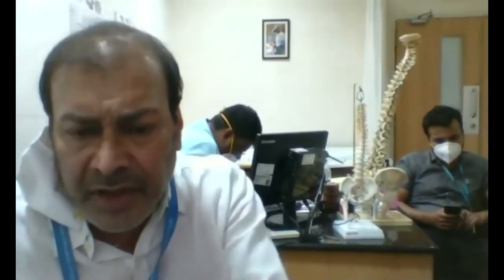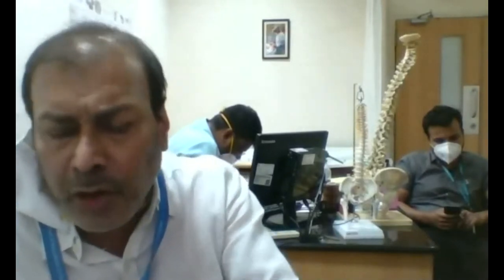Otherwise, in severe OPLL, if you try to remove everything, you end up with severe problems. Yeah, I'm talking about the OLF, ossification of ligamentum flavum. Oh, you mean in the thoracic spine? Yeah, in the thoracic spine, yes.